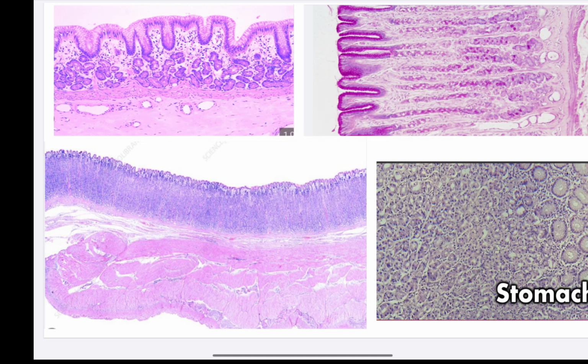There are no mucous glands in the submucosa, no goblet cells in the epithelium, the epithelium is simple columnar, the ridges are small, and the mucosa layer is quite bigger than the submucosa. These all favor the stomach rather than your concentrating on seeing the oblique muscle layer. So you can neglect that part, but for all theoretical purposes, you must know that there are three layers in the muscularis externa of the stomach.